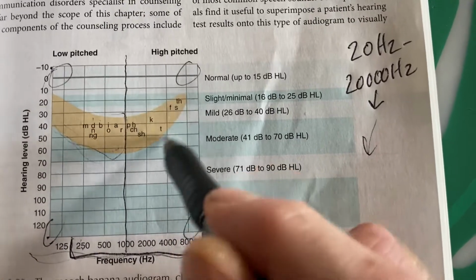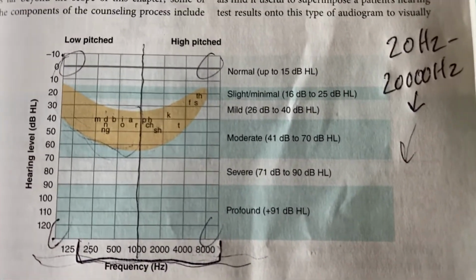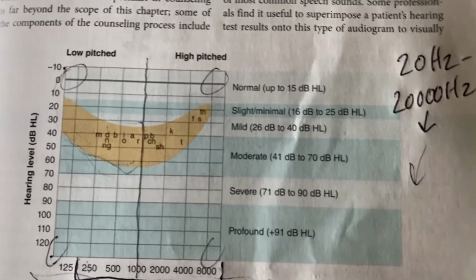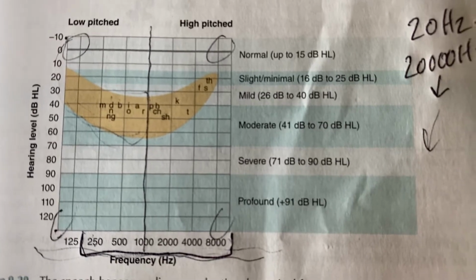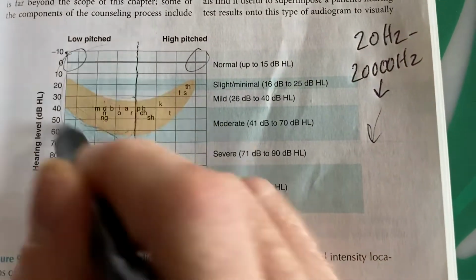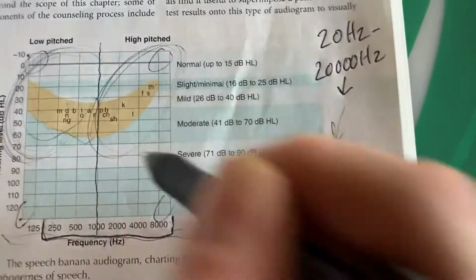The unvoiced sounds give speech its understanding, its clarity, its ability to be understood. So sounds that are loud are here. Sounds that are clear are here.